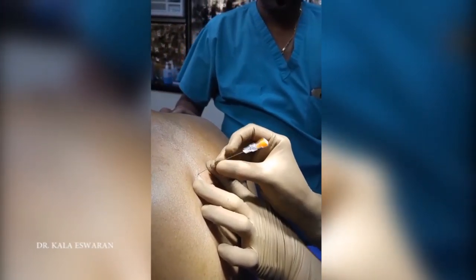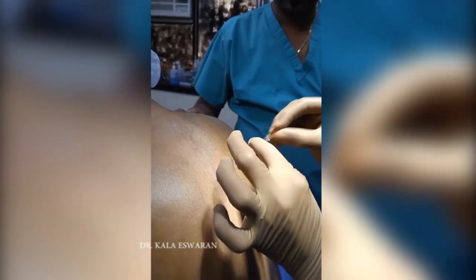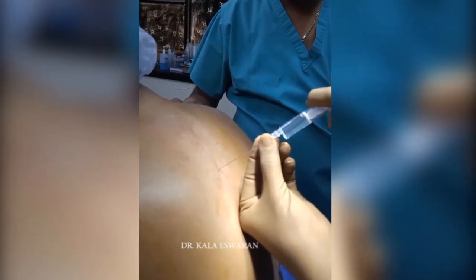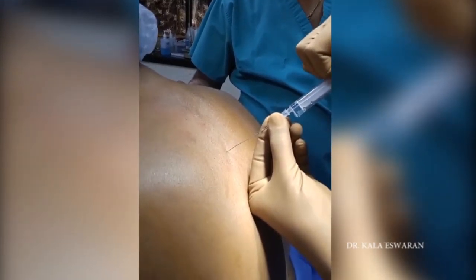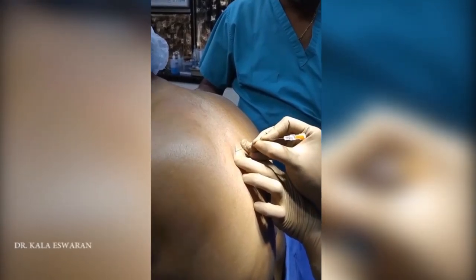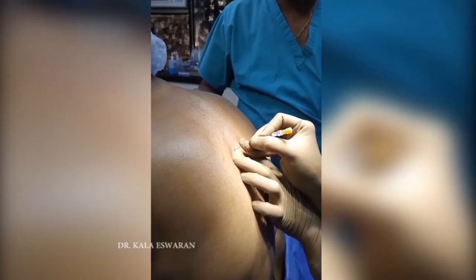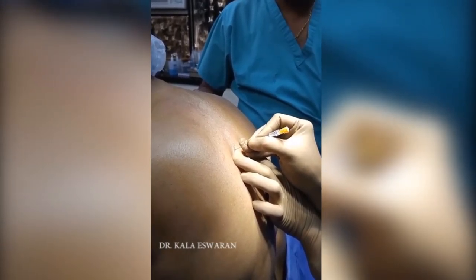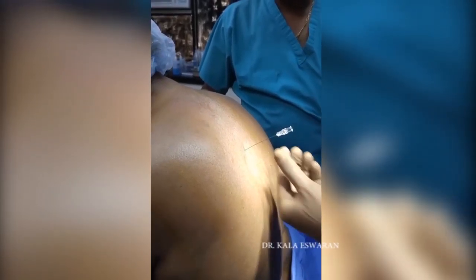You can see the transverse process being hit and the needle is being walked off caudally. The giveaway of the superior costotransverse ligament is felt. At each level, around 3 cc of the LA mixture is injected. This is the left side, therefore there is minimal difficulty because the hands get crossed over.